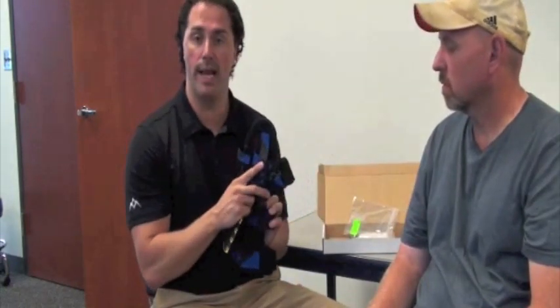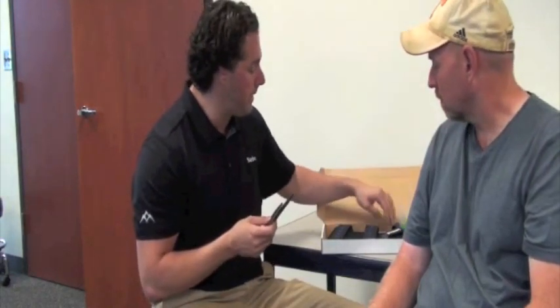Attached to the Sabo Stretch is a red hand plate. There are two other hand plates — one that's blue and one that's yellow. Yellow is for weaker resistance, while blue is for stronger resistance. And finally in the box, you will see a little tool kit, which includes a screw as well as a wrench for any adjustments or if you lose any screws.